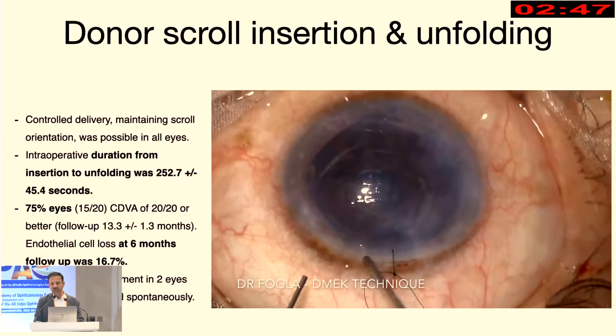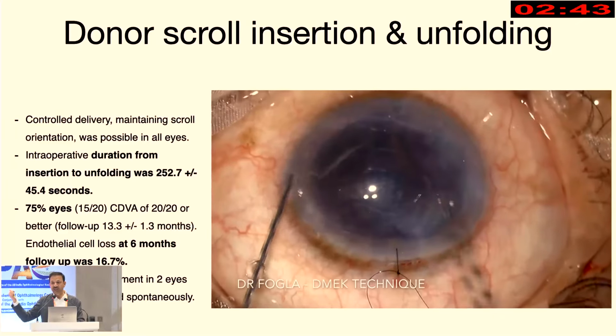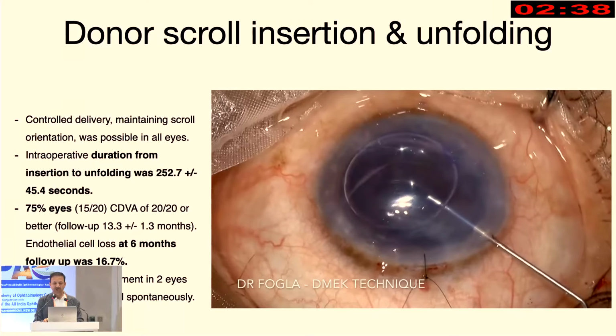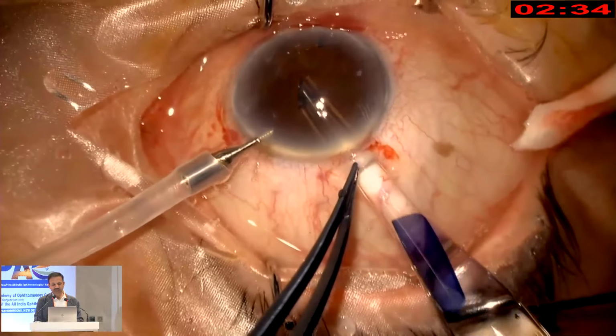And you can see now you can go and tap on the other side, your scroll is already open. So this video is actually in real time, it's not been edited, so it hardly takes a minute or two for unfolding the DM scroll. You can see another video, again the same.